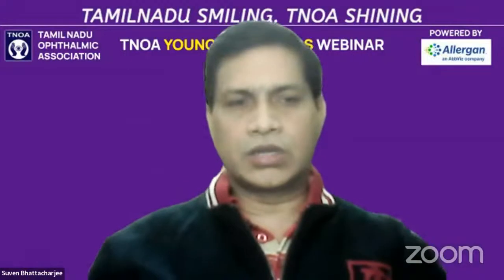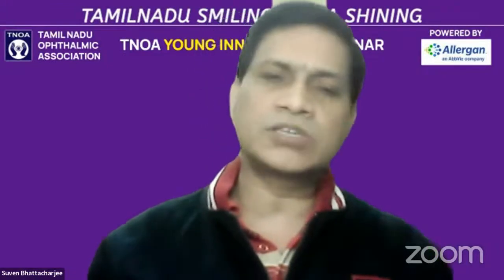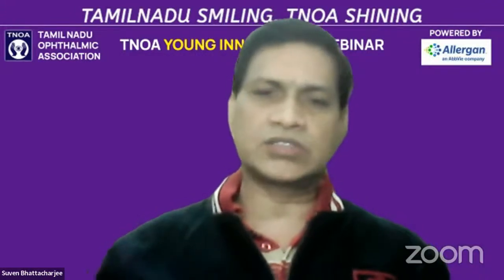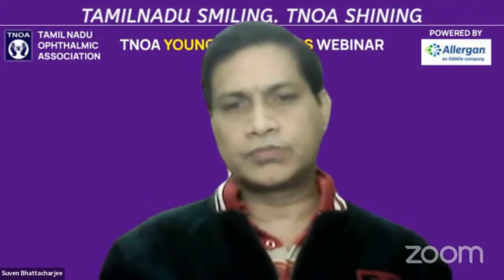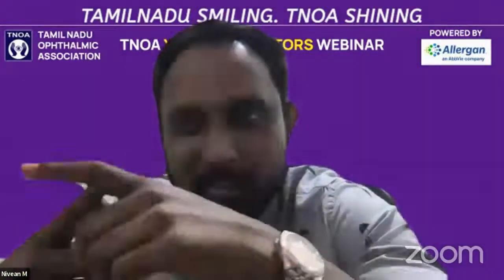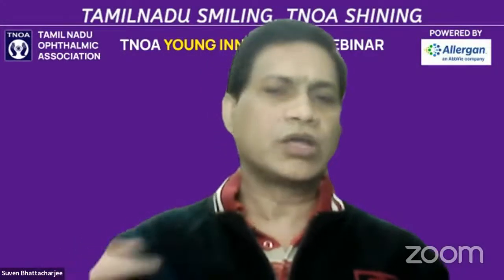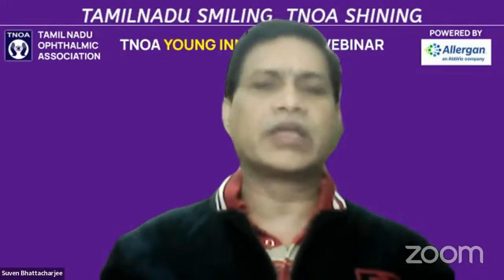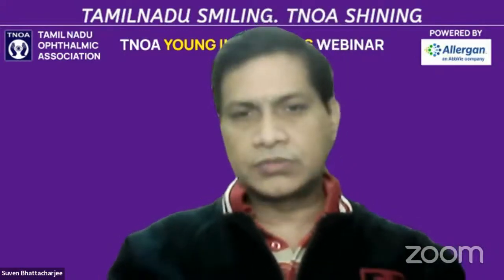Nivean, the only way you can make your design more flexible for all sizes of eyes is to have a concept like the plastic ties we have for shopping bags, or even for electrical wires. Those ties have serrated parts, and they lock in when you pull. So adjust the size. Yes, something non-return, you pull it once and it locks. But that will become very cumbersome, because this is just food for thought: the external part will again have to be adjusted, but that's the only way you can have it adjustable. You have to give the user the adjustability for different sizes of eyes, because the sulcus to sulcus diameter is going to vary.